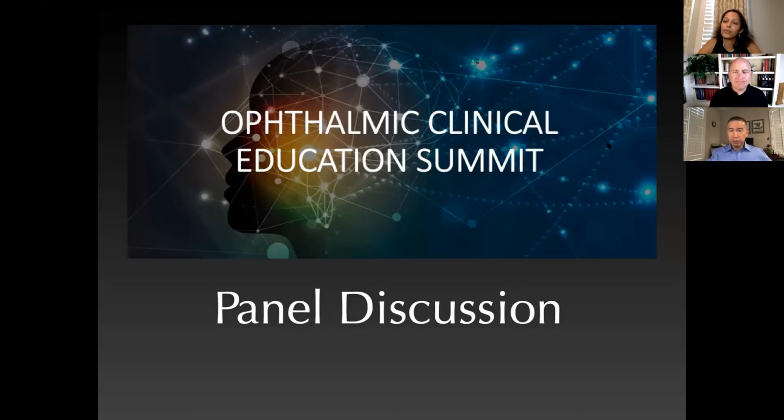Also for centration, there's actually no real clinical data that shows, unless you have something that's grossly ectopic, that angle kappa, chord mu, Chang-Waring chord, whatever you want to call it, directly affects the outcome. It's mainly where that lens ends up sitting that matters. If you decenter, you're going to induce astigmatism, which can be fixable. You'd like not to. None of these things are hugely critical with a strict cutoff, particularly if you use a lens that has good image quality, good MTF, where you have some give in terms of your image quality for the patient.